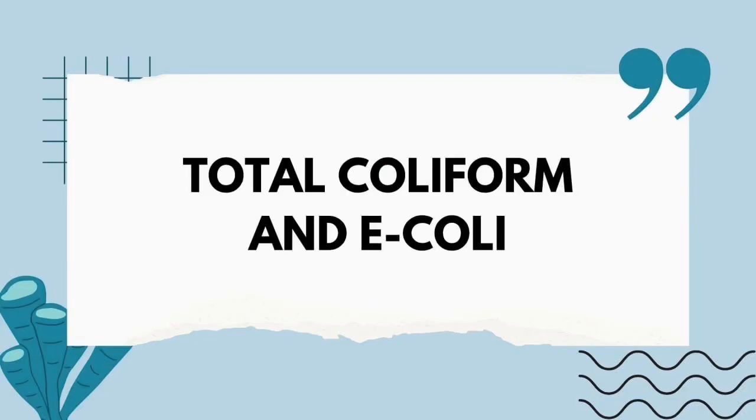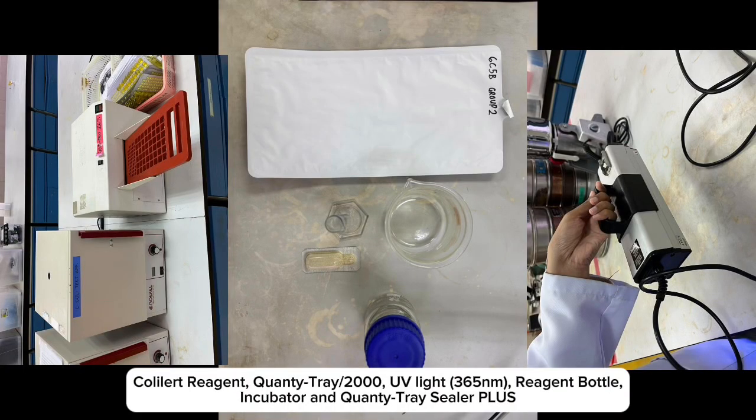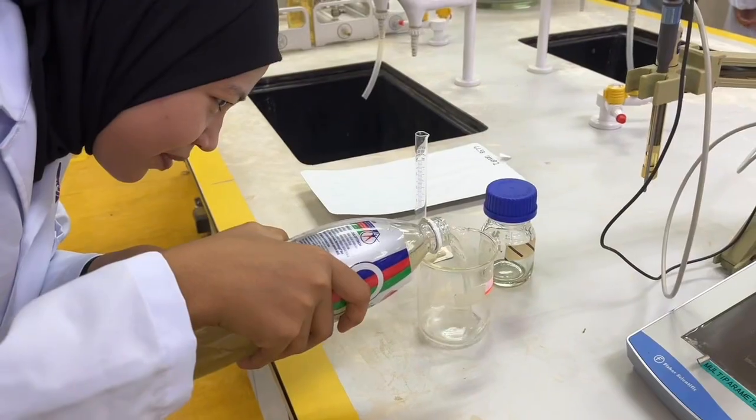The first test is total coliform. The apparatus starts with Colilert reagent, Quanti-Tray 2000 tray with 97 wells, reagent bottles, a UV lamp of 365 nanometer used to detect fluorescence from E. coli, a Quanti-Tray sealer plus, and an incubator with incubation temperature of 35 degrees Celsius.